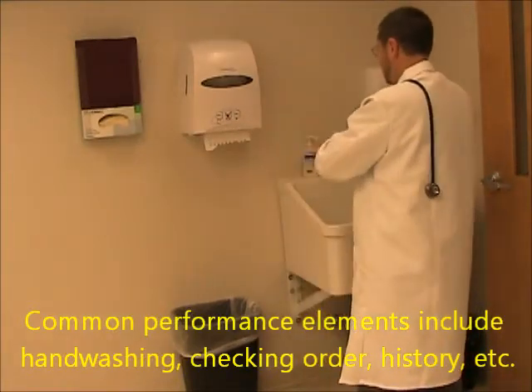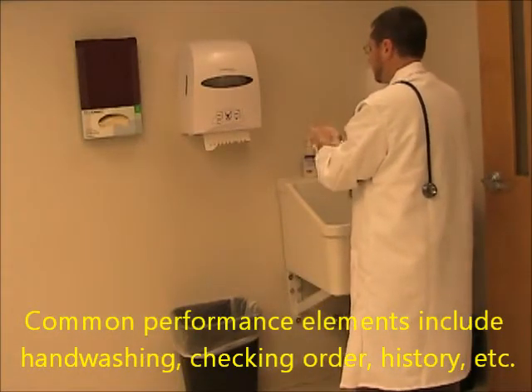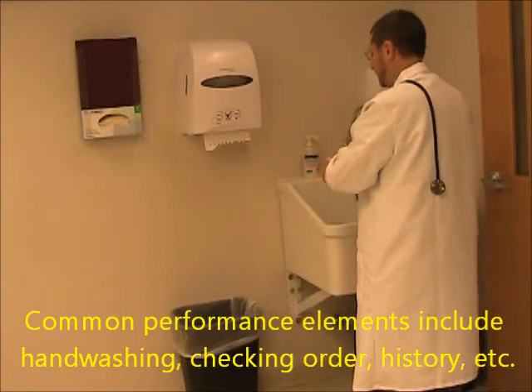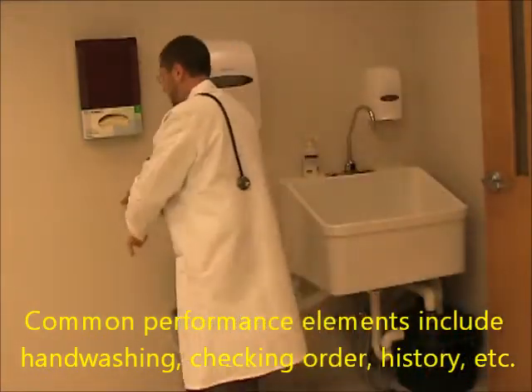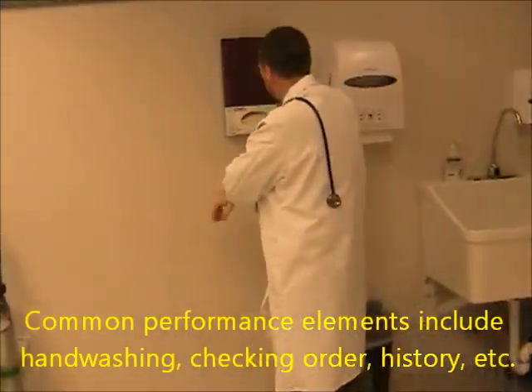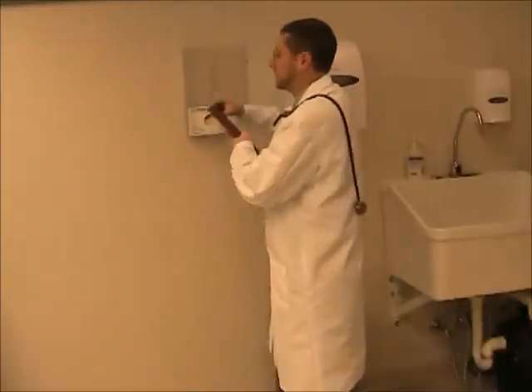This is the Oxygen Therapy Checkoff. It starts with common performance elements, steps 1 through 10.